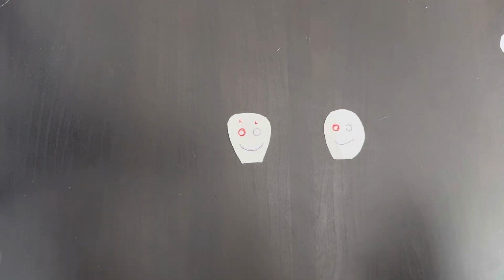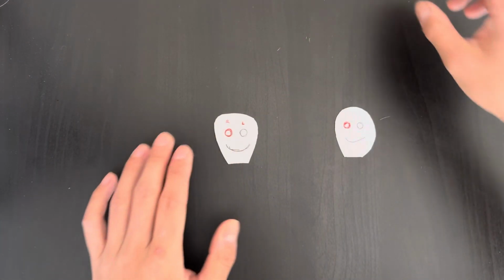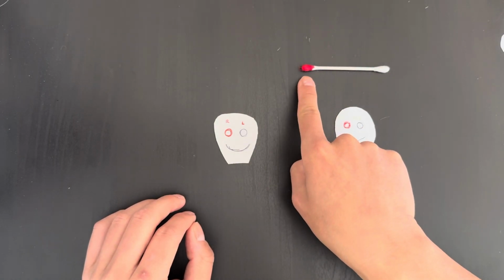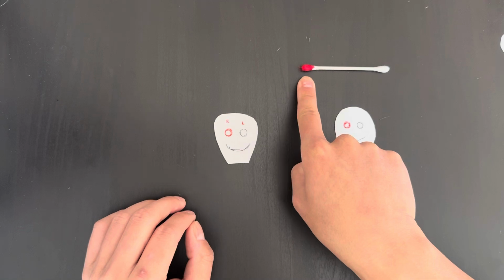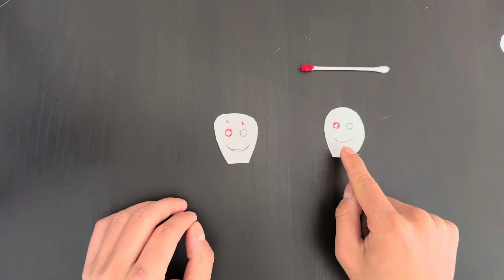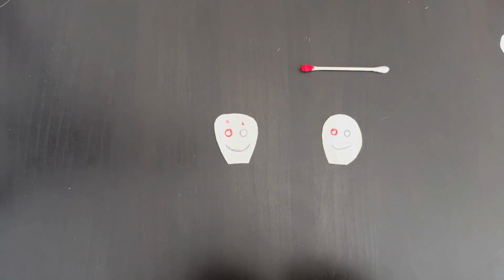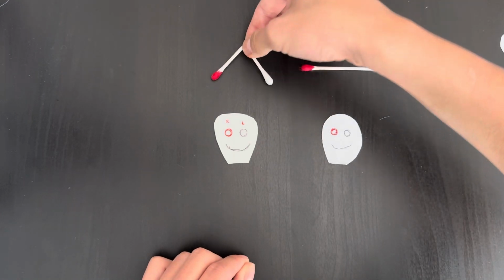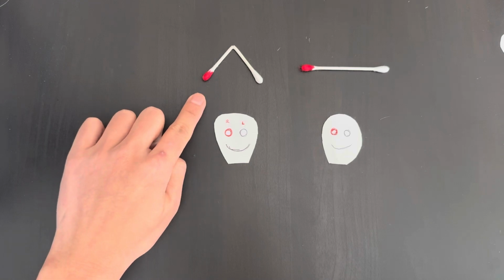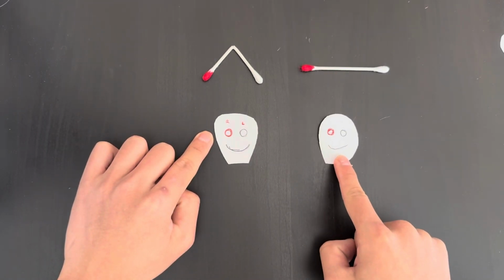Now, we're going to imagine cameras are like ultrasound probes and they have markers, okay? So let's say I have my camera set with a marker towards the left, my left, and in this case, the patient's right. This is the final image I want to show somebody. And so if I were to take a camera, I would also want my camera, or my probe, to point that probe marker towards the patient's right, because that's the end product I want to show.